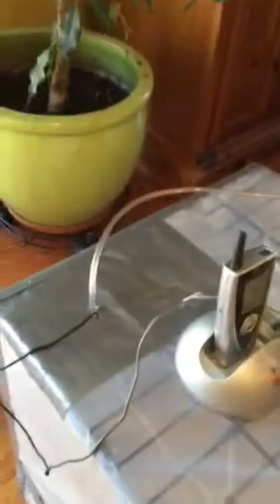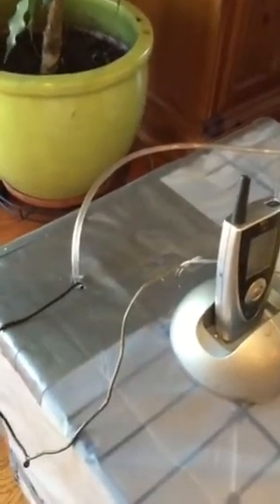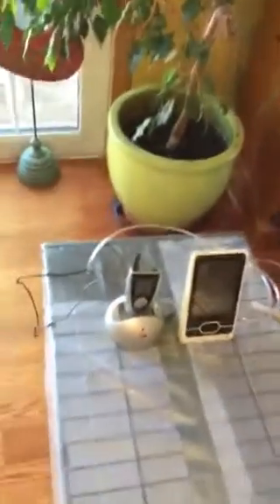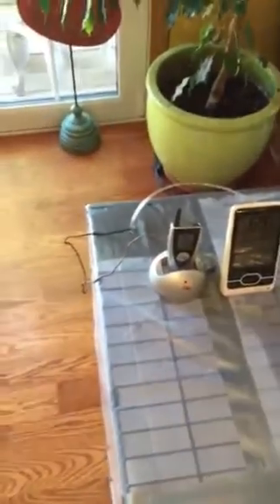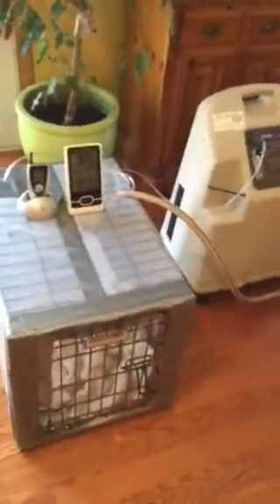Now on the back also you'll see the clear tube, and that's my oxygen tube coming from the concentrator, and I put it on top because oxygen is lighter than carbon dioxide. So this way the oxygen will stay on top and the carbon dioxide, in theory, should come out the small holes in the ventilating. So this way the dog won't get sick and won't be like he's in a plastic bag breathing his own exhaust.